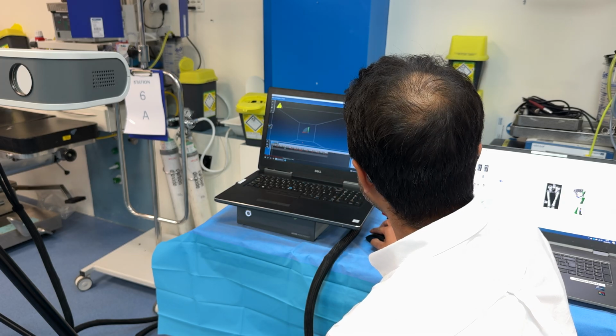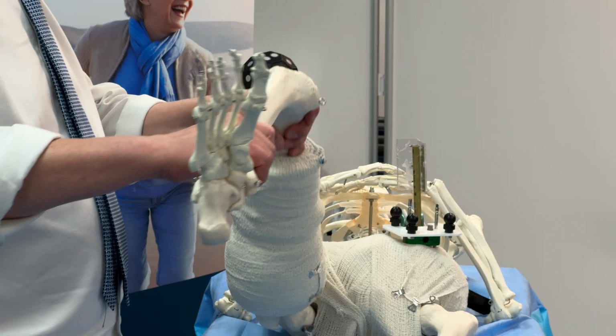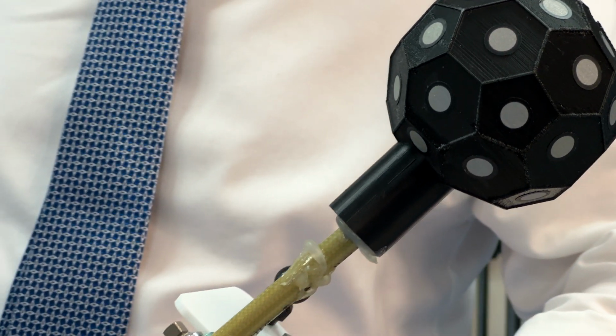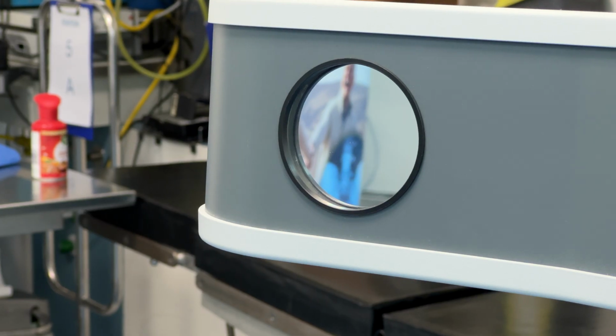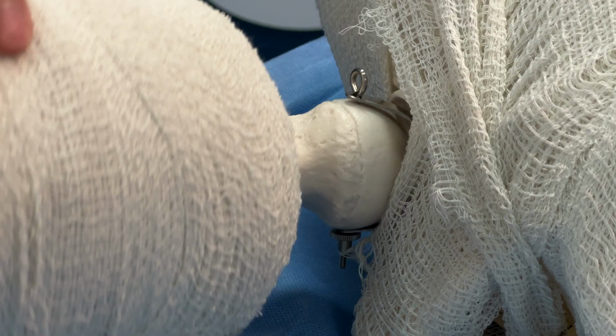Warwick Manufacturing Group has been using reflectors and sophisticated cameras to capture all the ranges of hip motion in patients to create a computer model that can work out what your hips used to do and how a replacement joint can mimic that. Now, using that hip geometry, you can simulate different activities, and you can then predict what the patient used to do and what the range of motion was when the hip was good.